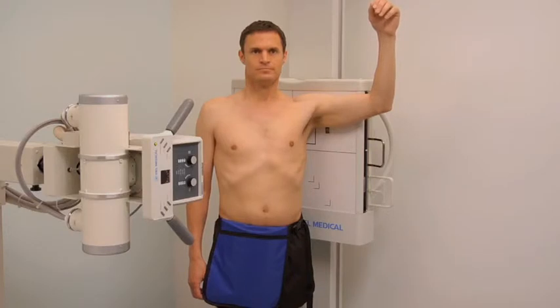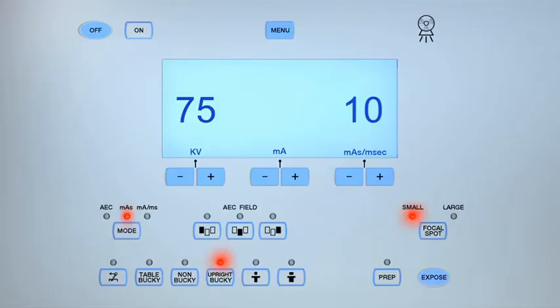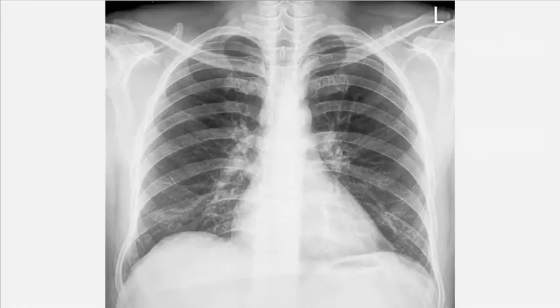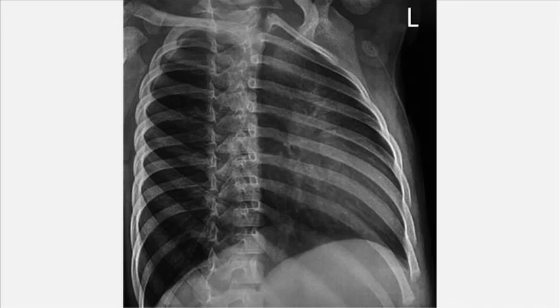Ask the patient to breathe in and out and hold on the second breath. Expose the cassette. Review the images for both projections.